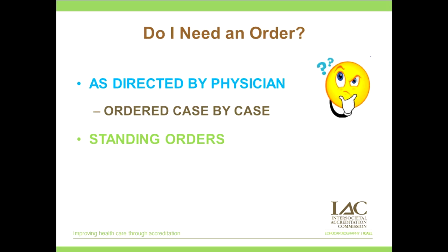These orders can have precise indications and contraindications. Because the standing orders contain these precise indications, the sonographer will be able to determine if contrast is needed.